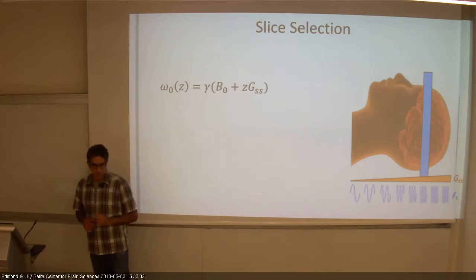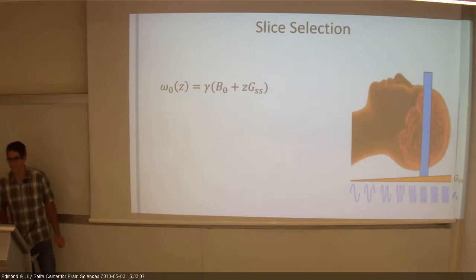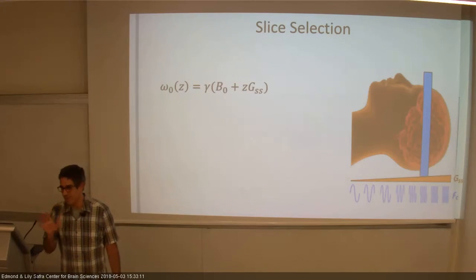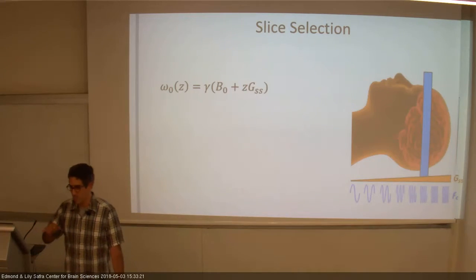Yes? You're very quiet. I don't know. Yes. Okay. For each slice, we get this map from the Fourier, and then we can plot it. Well, first select the slice, and now we're going to do the 2D Fourier. So I moved a 3D problem to a 2D problem. Still have a 2D problem. Now I'm going to do all these things with k-space. Okay?